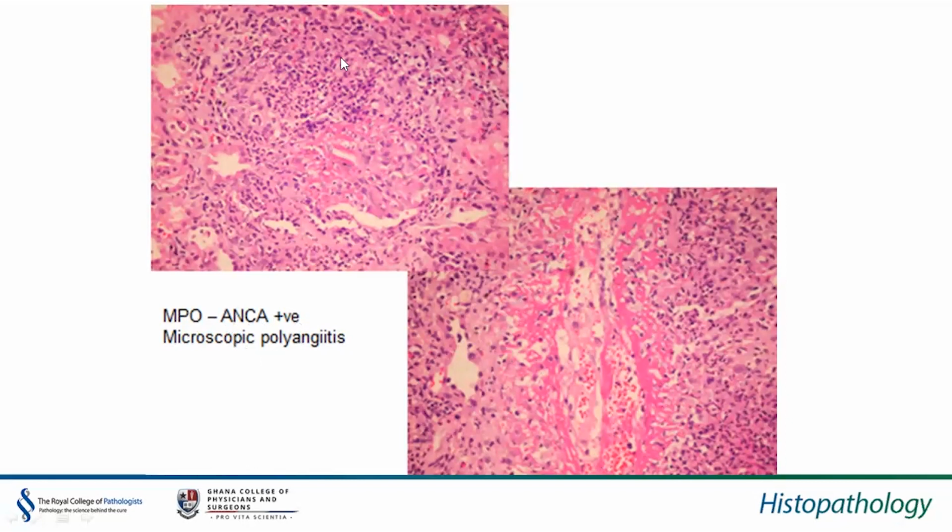So when you see a lot of activity aggregated like this in the interstitium, almost granuloma-like, don't forget to cut deeper, go deeper, because that granuloma may actually be an underlying necrotic vessel or an underlying necrotic glomerulus, which would help give you the diagnosis.